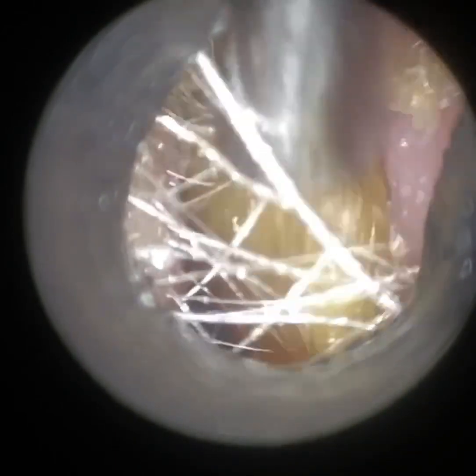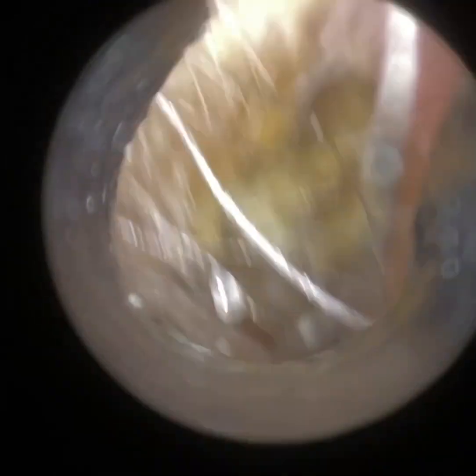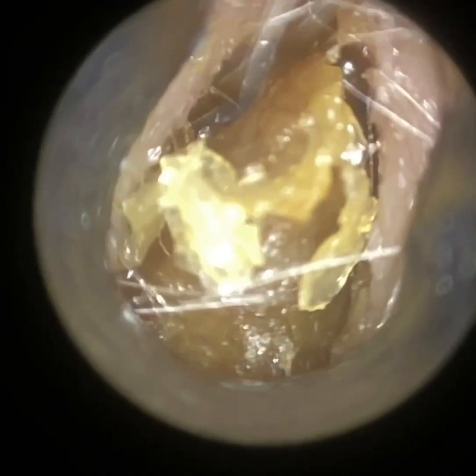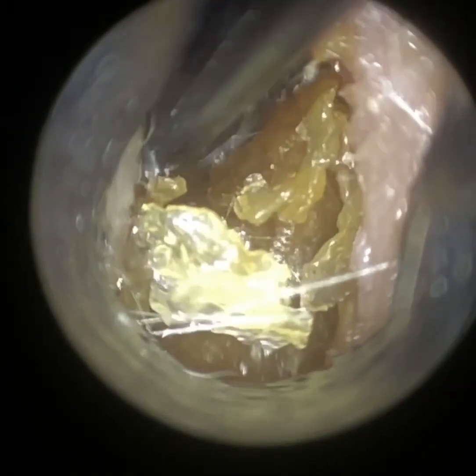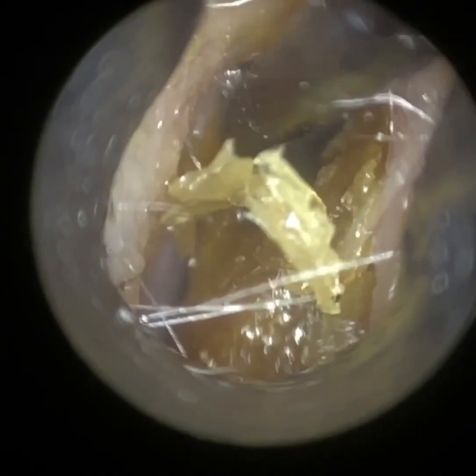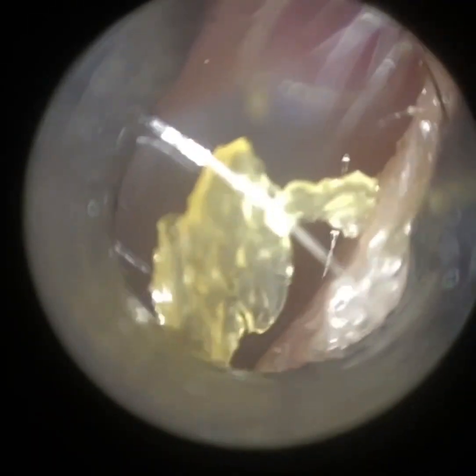Most ear speculums are designed to go about a third of the distance into the ear, because if it goes any further than a third of the distance, it will become in contact with the bony part of the ear canal, which will be quite uncomfortable for the patient. So I'm just now going to use a hook, and you can see how I'm reorientating the hook to get into the narrowing. Then I'm going to turn the hook — like a key in a lock — and it's embedded itself within the wax plug, and I've managed to extract it.